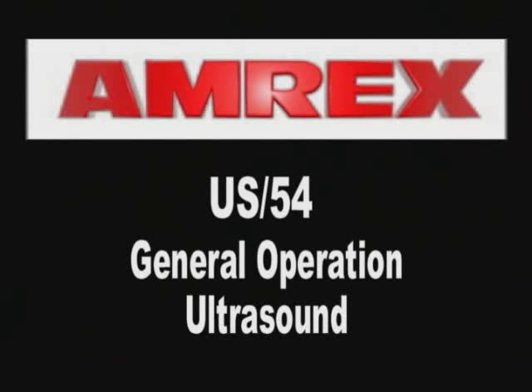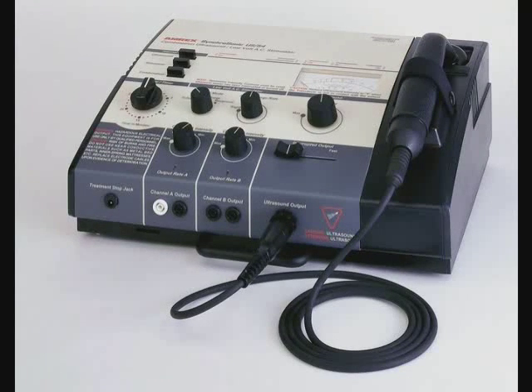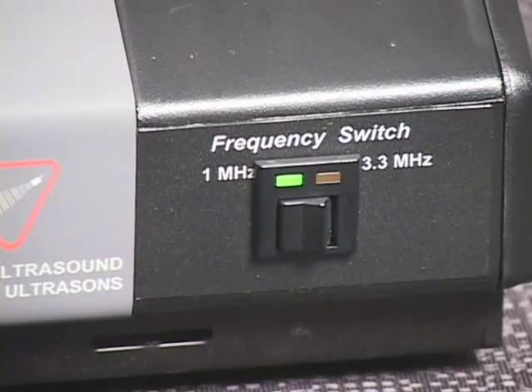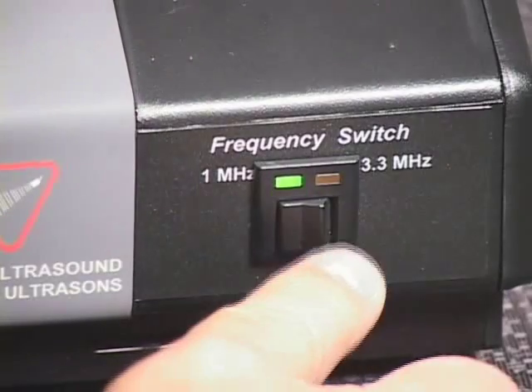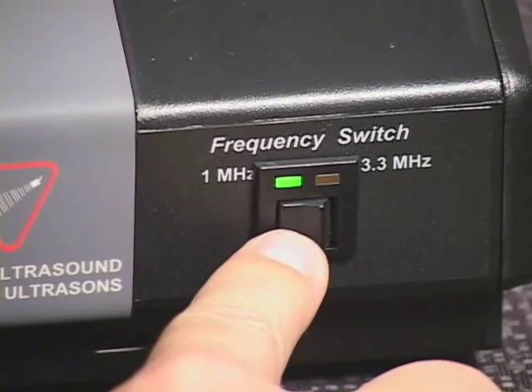US54 General Operation – Ultrasound. The AMREX model US54 ultrasound modality has a standard output of 1 MHz frequency. AMREX does offer both 1 and 3.3 MHz outputs as a device option.